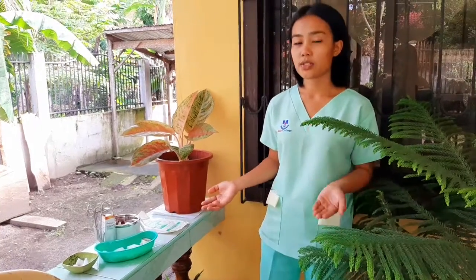Ma'am, good day. For today, I will be doing my return demonstration on wound care. First, I'm going to review the medical orders for the dressing change procedure. Next, I'm going to explain the procedure and instruct the patient not to touch the wound area, especially the wound and the sterile supplies.